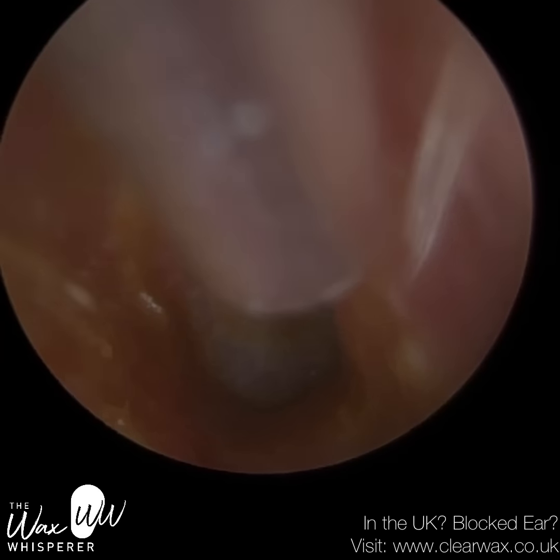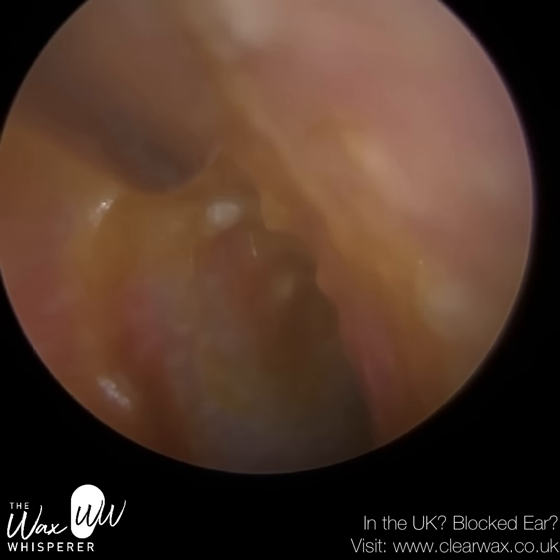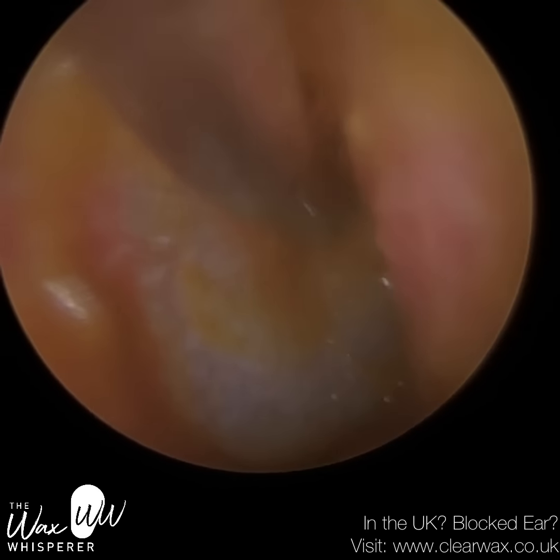Then you've got the main handle, which is the bit that you can see going upwards from the middle, and we call that the manubrium. And then at the top, we've got the short process, a part of the hammer bone that protrudes outwards. This patient's is protruding out a bit more than the norm, but it's fine. I think I'm more or less complete.